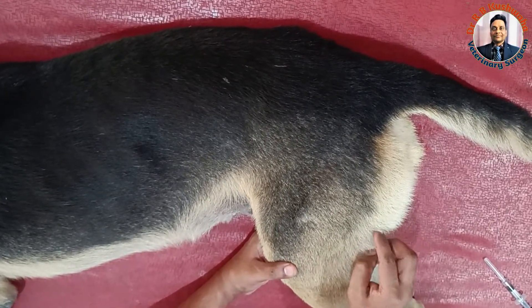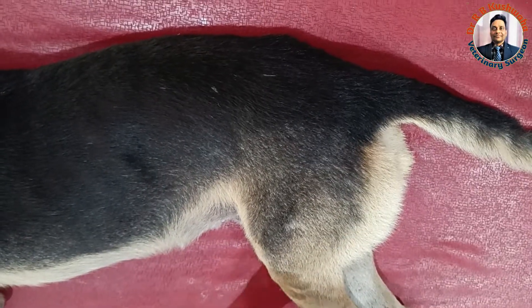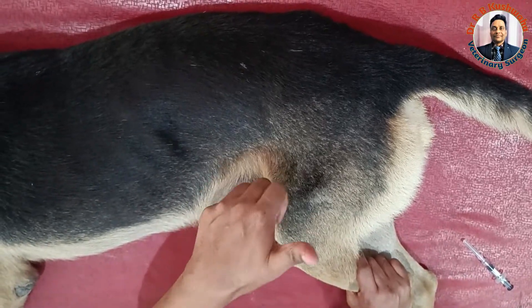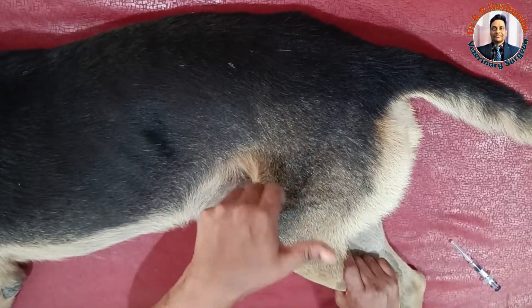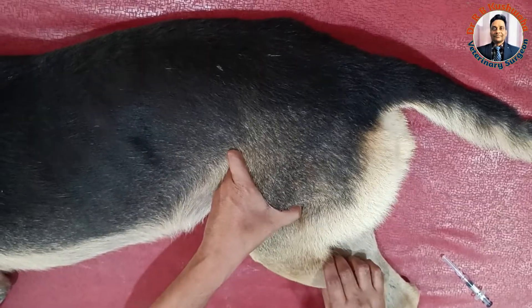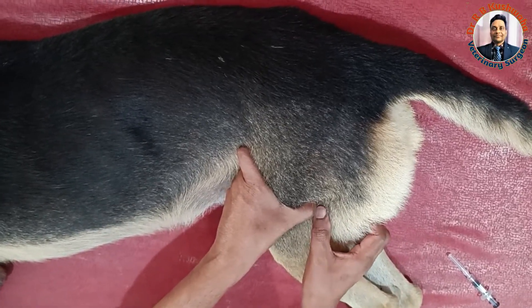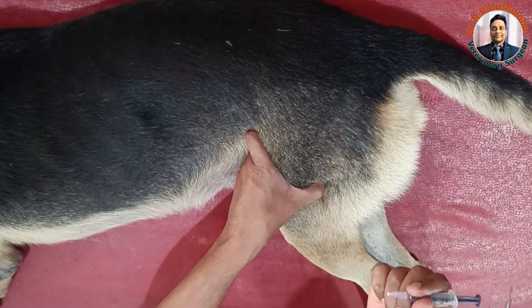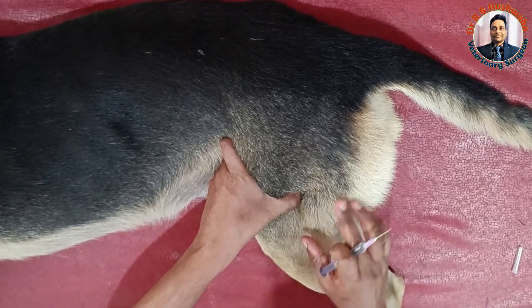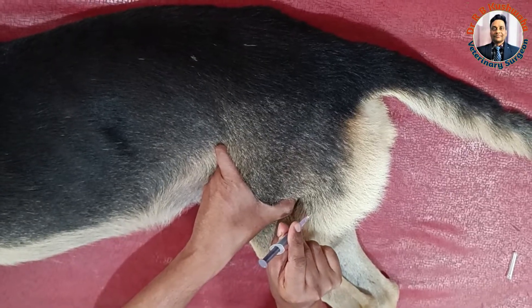Normally we give the injection here, not at the very caudal end. The needle should not be inserted straight in — insertion is always facing towards the caudal side. To give the intramuscular injection here, keep your non-working hand — the left hand if you are right-handed — with the thumb just at the caudal surface of the femur. This way you can avoid piercing the sciatic nerve, because the sciatic nerve runs just caudal to the femur bone.